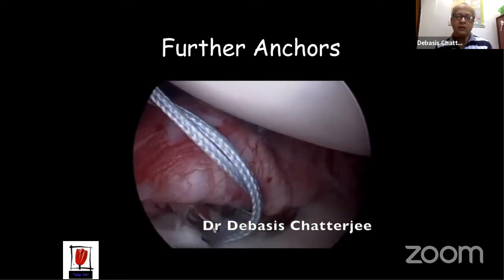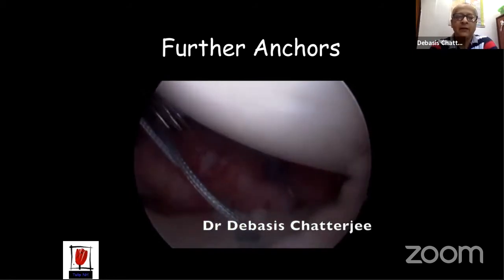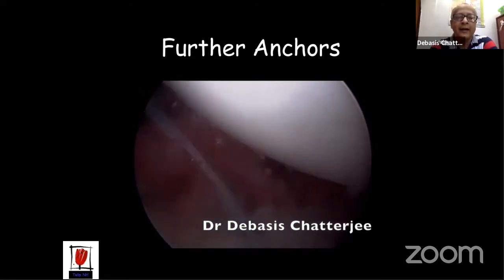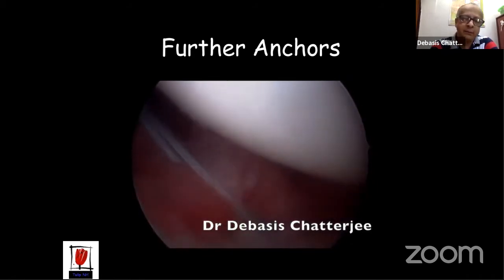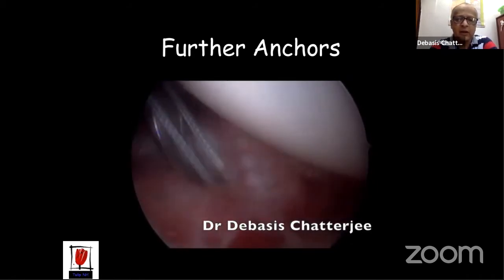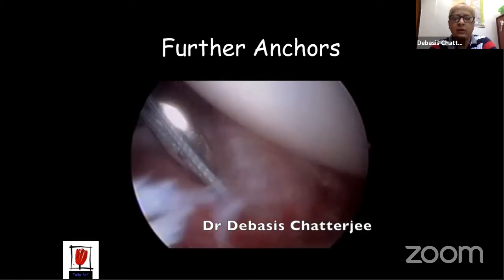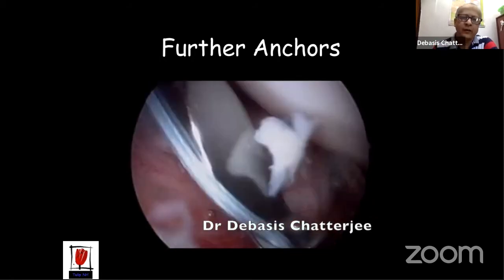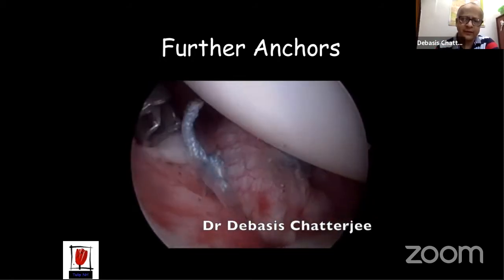Once you have taken the bite, you complete your suture, tie your knot, and you can keep on doing this until you feel the whole labral tear has been repaired. Generally, people go up to 2:30 or 2 o'clock, and they use about 3 or 4 anchors, 3 most of the time for me.